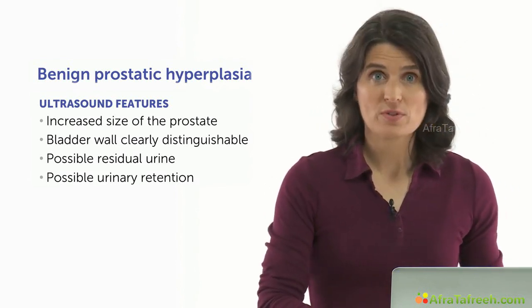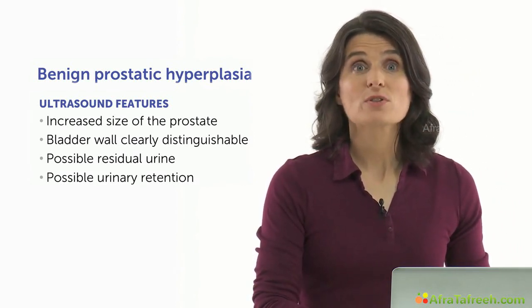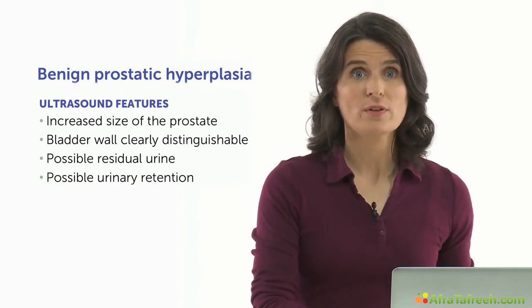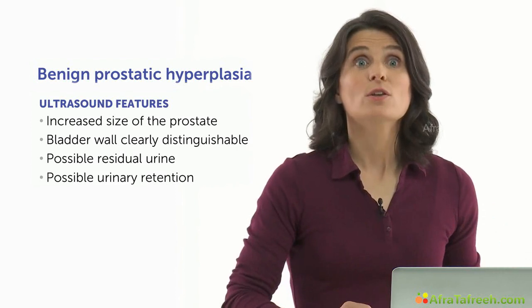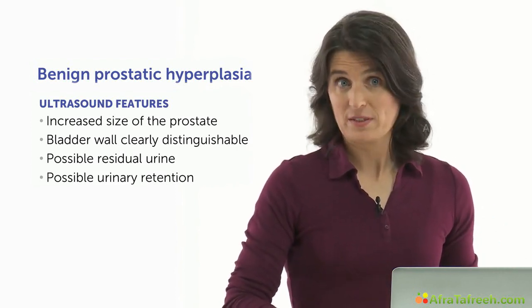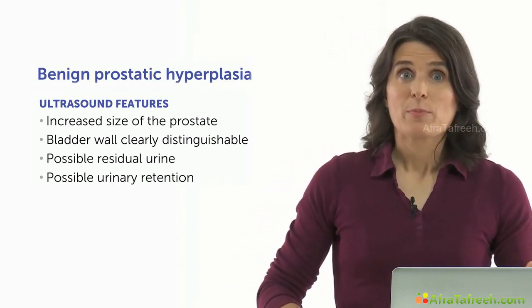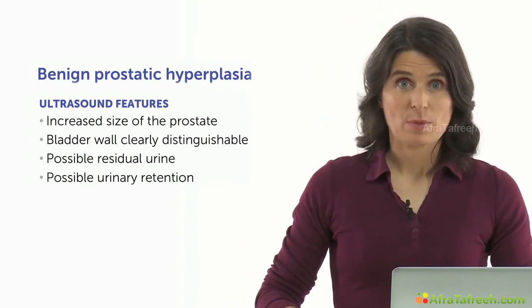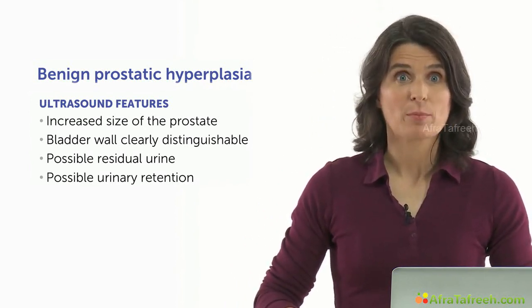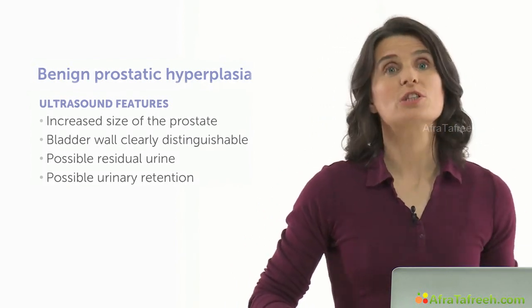An enlarged prostate can be a cause for urinary retention and can subsequently also cause hydronephrosis. So remember, a filled urinary bladder with no urge to void may be an enlarged prostate. You should also take a look at the kidneys if you didn't do this already during your complete scan. When detecting a hypertrophic prostate, I always ask my patient if the condition is already known and if he has a regular checkup at his urologist. If that's not the case, I send him to a urologic checkup.